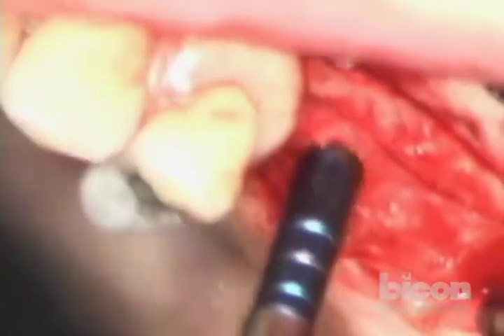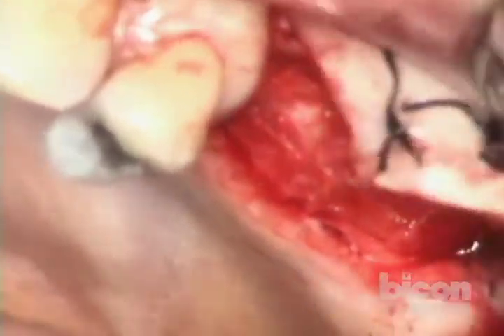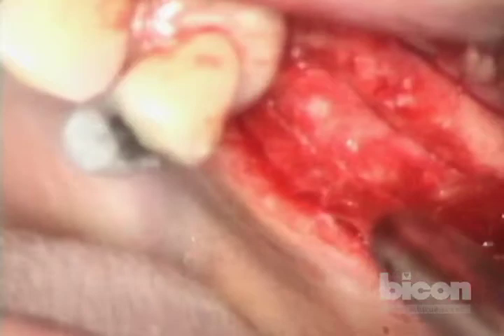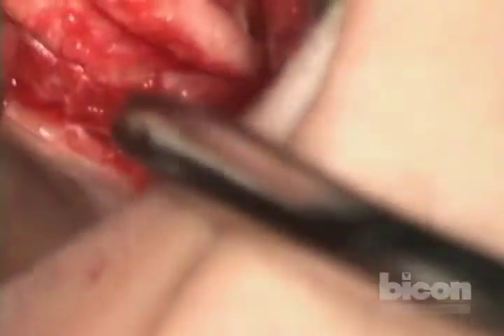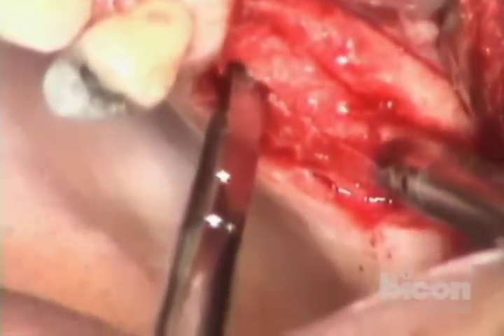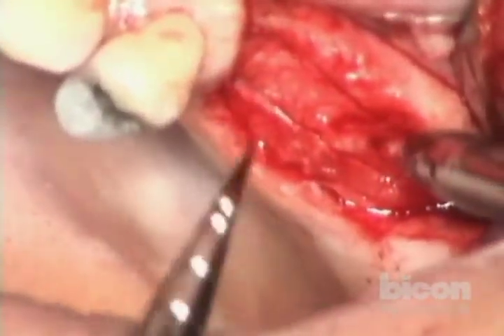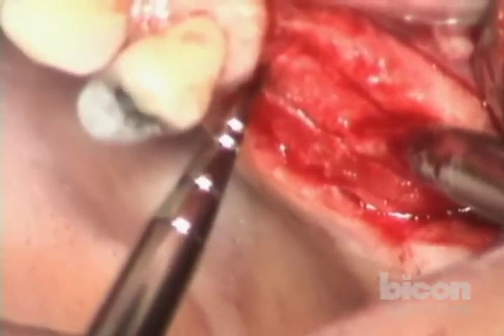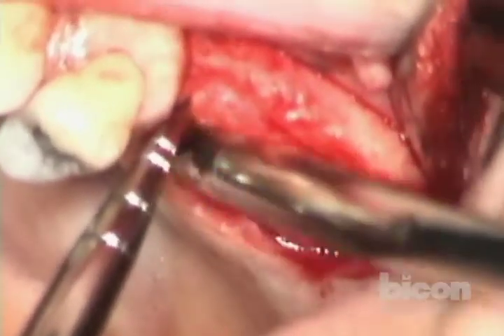In fact, the very first case I did was without any scoring with the chisels. I think we have a little binding area in the corners. I'm going to use a smaller chisel — the three millimeter chisel — and go into the corners. Those are the hardest to cut, just to make sure the cut is complete. We're not doing the work twice, just completing what we started.